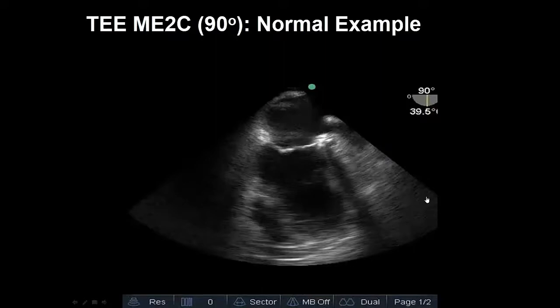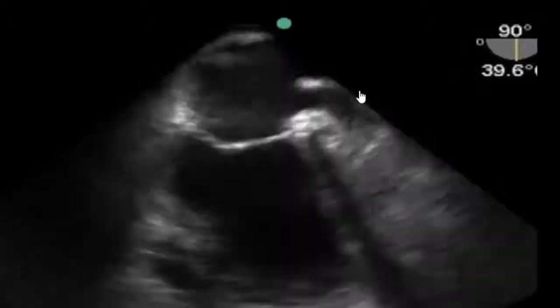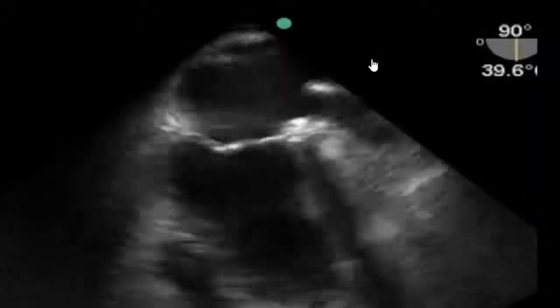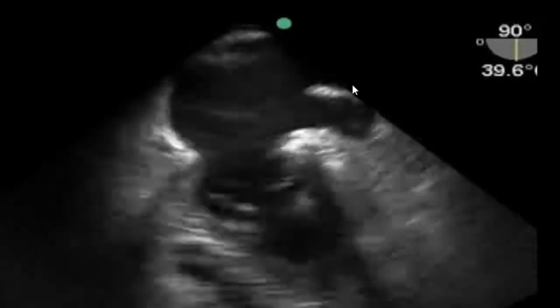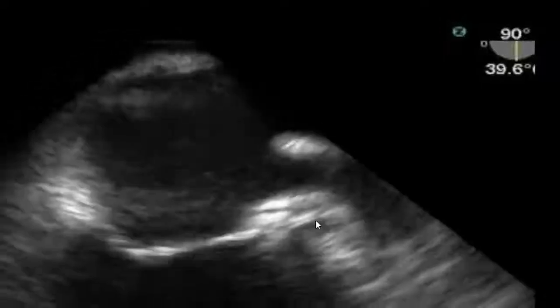Next, we focus in on the left atrial appendage, seen here, and we zoom in on it. And we see that we have a wall known as the Coumadin ridge, seen here, or the Q-tip sign, a prominent muscle ridge formed between the left atrial appendage and the left upper lobe pulmonary vein, sometimes mistaken for clot. In patients with AFib or low flow state, the left atrial appendage is a classic place where clot may form, and we're primarily zooming in to see if there's any obvious 2D imaging of clot within the left atrial appendage, which is not seen in these pictures.